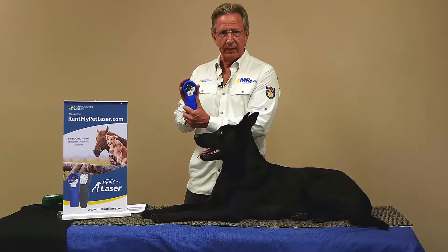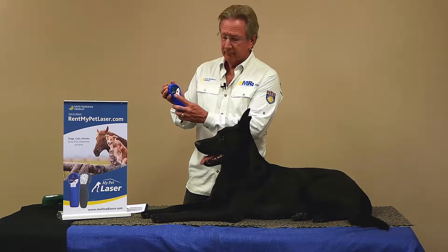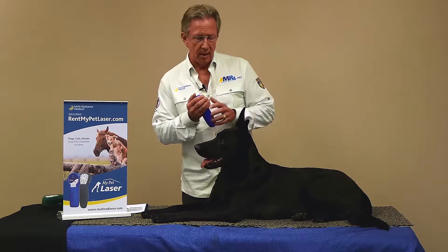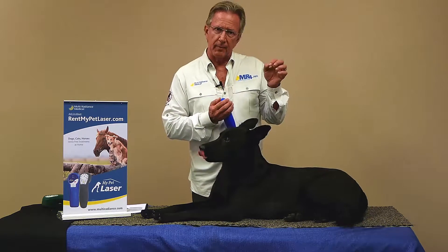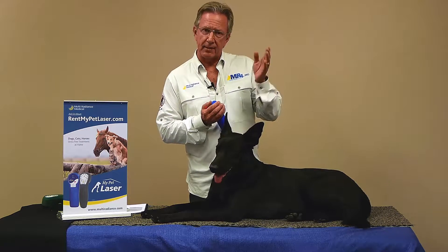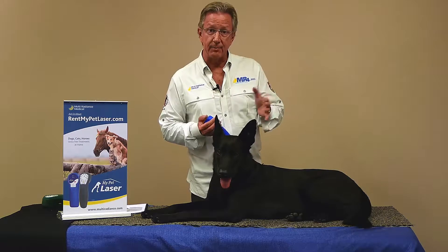We'll move this down to setting number three — that's our 1-3,000 Hertz — and just push the on button after you've set it and you're good to go. It has a preset timer. You can see the red light flashing. The visible red is also accompanied by two other wavelengths: the 875 and the 905, and that's the super pulse laser that gives you the depth of penetration we need to address deep issues like arthritis.